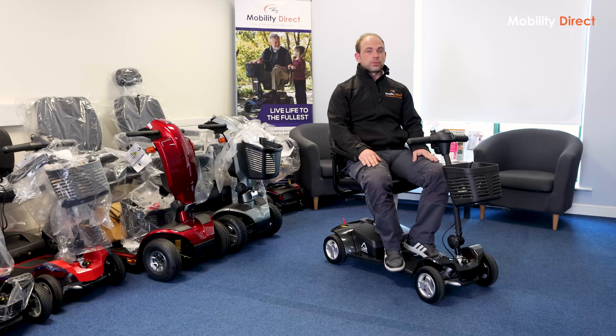The other thing to point out is that the batteries are more expensive to replace. Lithium is still a relatively new-ish technology, so over time the price will more than likely come down. But at the moment it is more expensive. On the other side, they also last longer than lead-acid, so over the life of the scooter it's probably not going to make much of a difference — but it's just something to make you aware of.